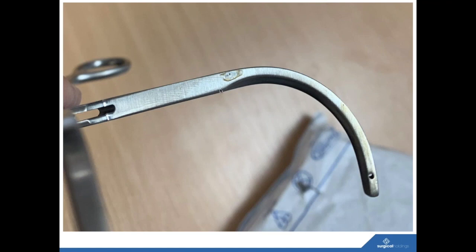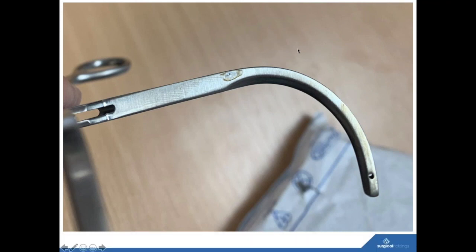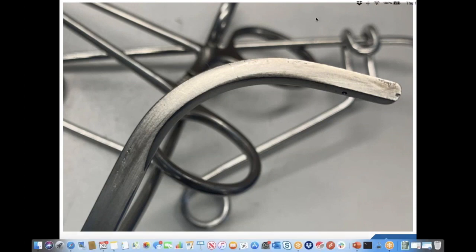But again, this really shows the importance of cleaning the devices thoroughly after they've been used, or as well as you can in the time you've got, and just monitoring these key areas where there may be pressure on the device or contact points. I think you can also see on the end of the device that where again it's closed up and tight, perhaps when somebody's finishing using it, they're closing it up. You've got the pitting picking up on the end there, which obviously we don't want to be seeing.